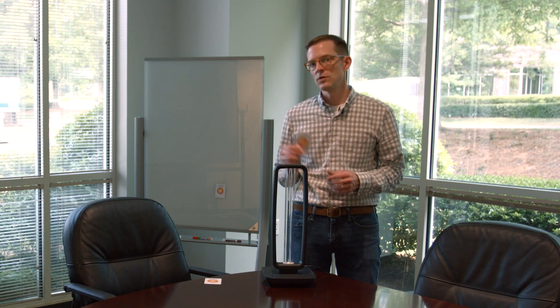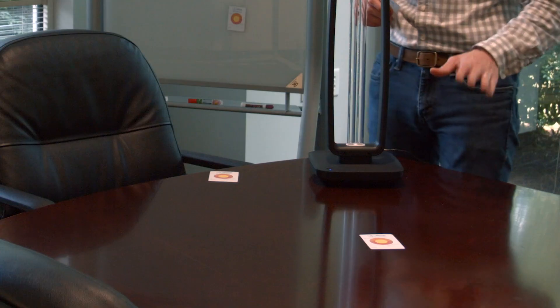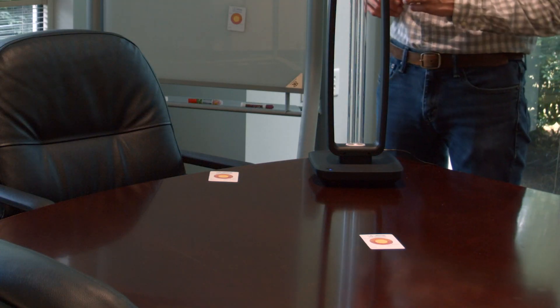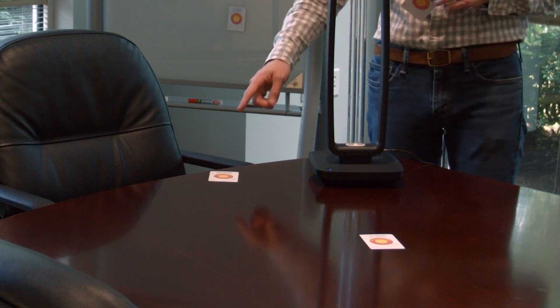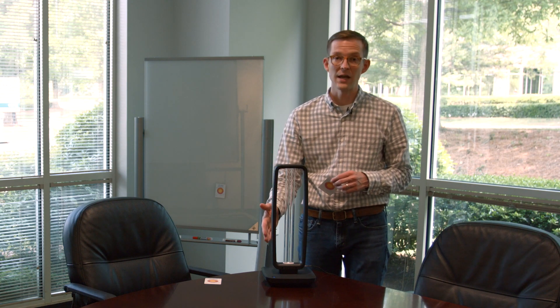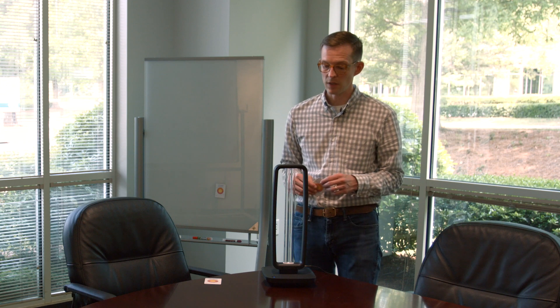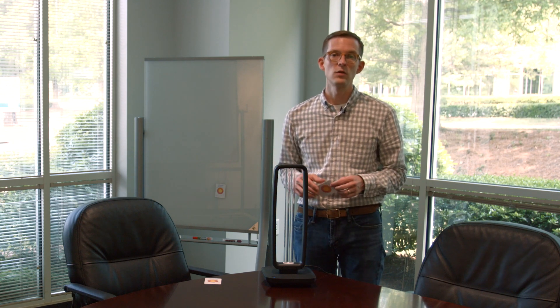I've placed a few of these dosimeter cards around the fixture. One is in front of the unit on the conference table. Another is in the shadow of this support on the fixture. What we really want to see here is: does the shadow affect the ability for this to disinfect surfaces around it, or are we going to have to place this in a few different positions to disinfect the whole area?